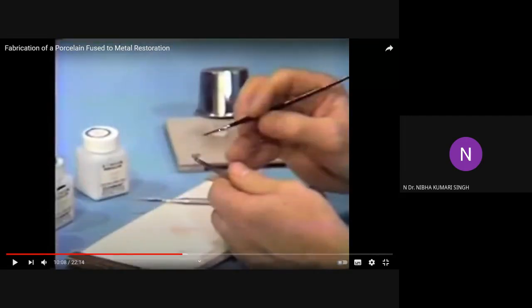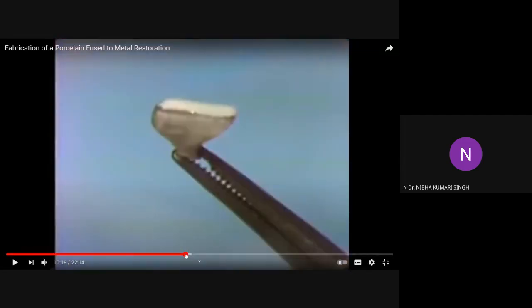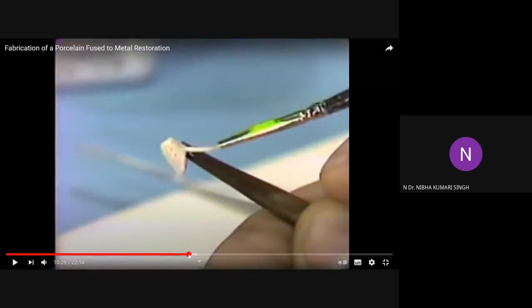Here they are applying the opaque layer on the metal crown. You can see the opaque layer they have applied. The purpose of the opaque layer, as you know, is masking the color of the metal. Also, this opaque porcelain is what forms the chemical bond with the metal. After that, firing is done again.